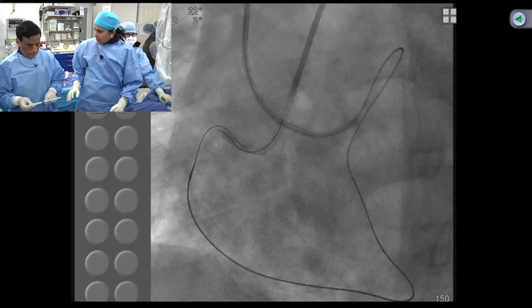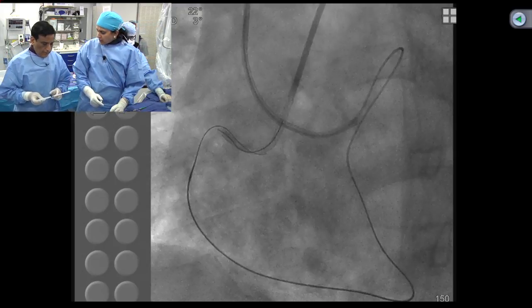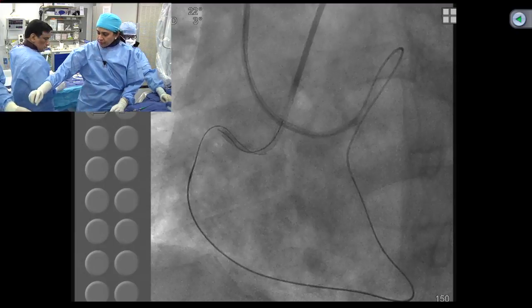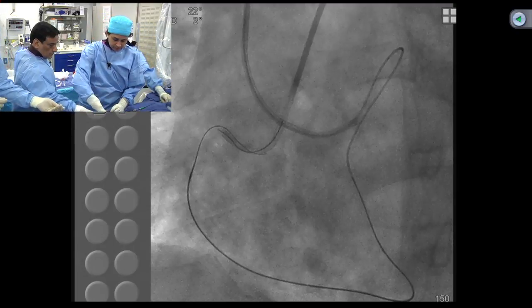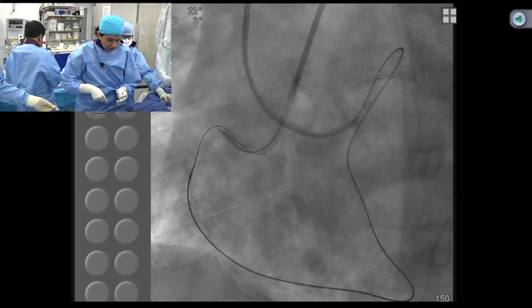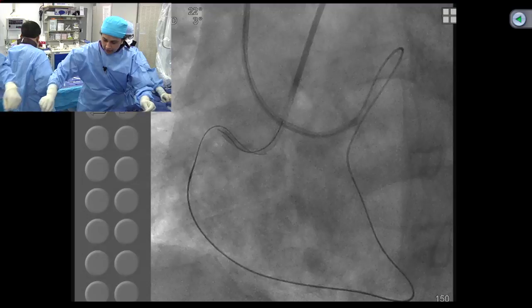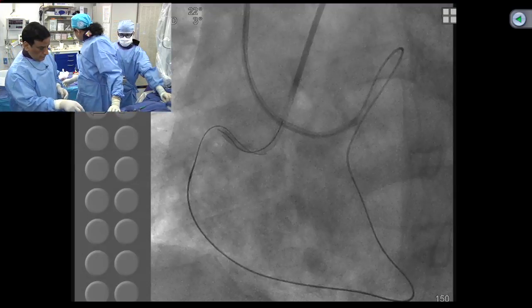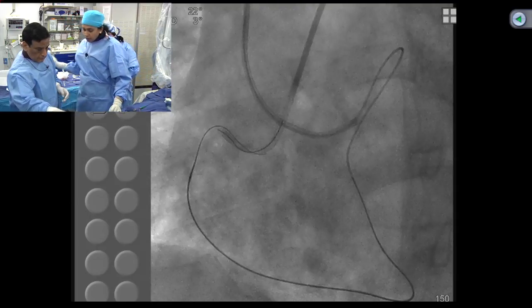No, why that one? Very difficult. No, right now you're there, so it will be okay. Get me regular Fielder. Oh, this is the regular Fielder. No, it's not Fielder, this is Miracle. Get another Fielder. Or we had Fielder FC. You can give me that too. You want to use that?